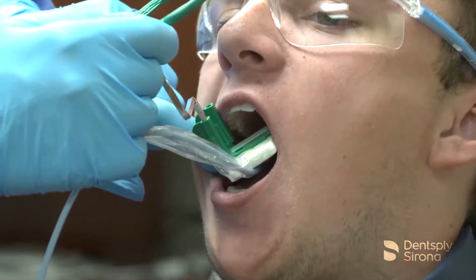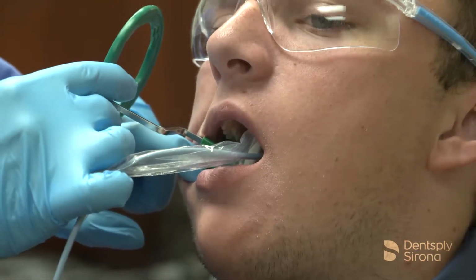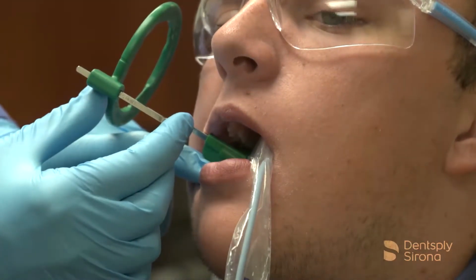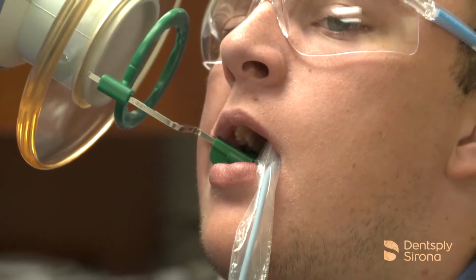Place the bite block into the patient's mouth and center it behind the area being radiographed, mindfully observing the treatment area. Utilize the handheld portable X-ray device to acquire the image.